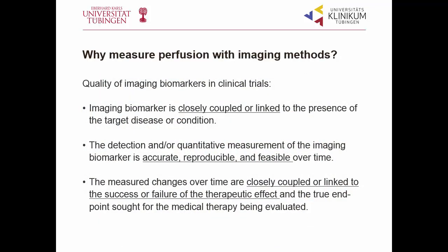And the second question is, why would we measure perfusion with imaging methods? So why would a clinician want to do this? The thing is that we want to get more out of our images than just morphology. What we are looking for is a biomarker. We want to find a parameter to characterize tissue.